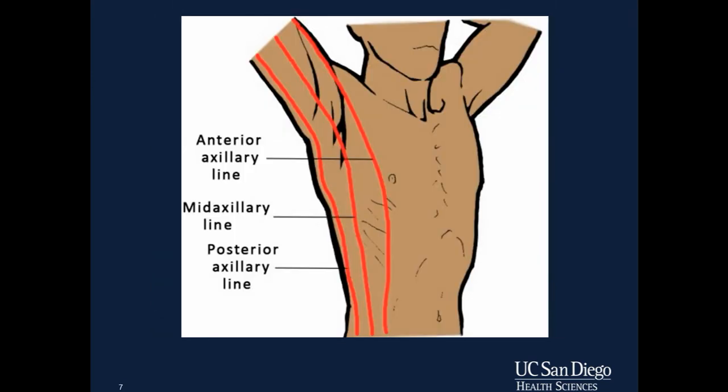Your approach for this side will be to place the probe in the right lower intercostal space in the mid-axillary line. Using the liver as your acoustic window, aim the probe slightly posteriorly. For the long axis view, you will start with the marker dot pointed towards the patient's head and then fan anterior to posterior, or belly to back.